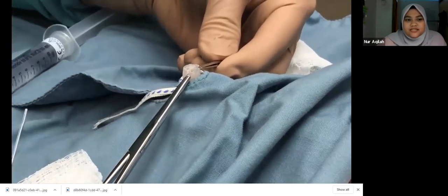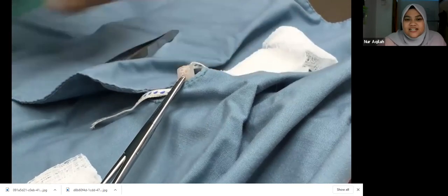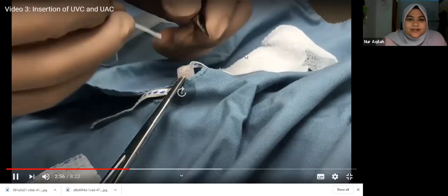After dilation of the umbilical artery, we are now ready to insert the catheter. Remember, we have flushed it through. But again, maybe take another look to ensure that it is truly flushed through and there's no air.